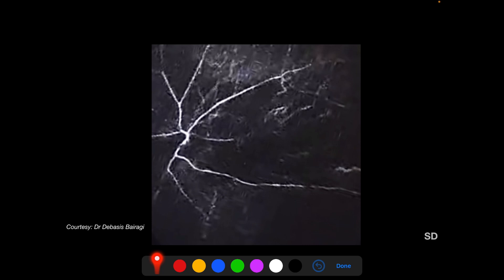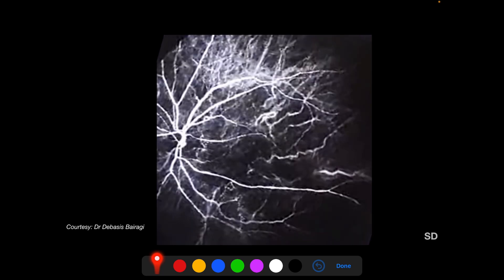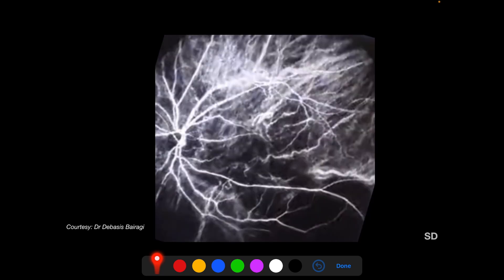We will first see the filling sequence of ICG dye, particularly in the early phases of ICGA, with two examples. In the first example we have still photos taken from video, and in the second we will see the actual video. In the early phase, the choroidal vessels have started to fill, and so have the retinal blood vessels. The choroidal vessels continue to fill, and in the subsequent photograph filling of both the choroid and the retinal circulation is complete.